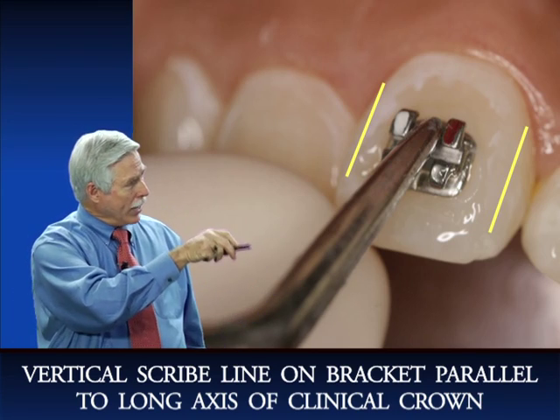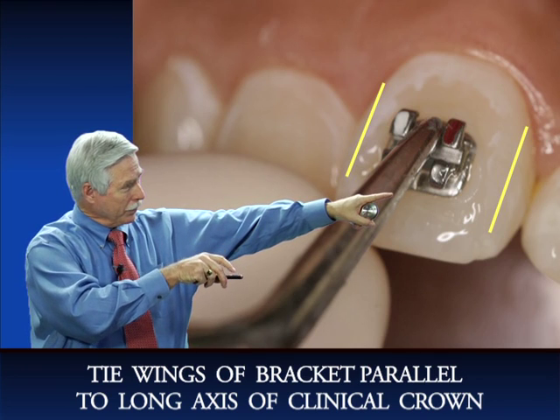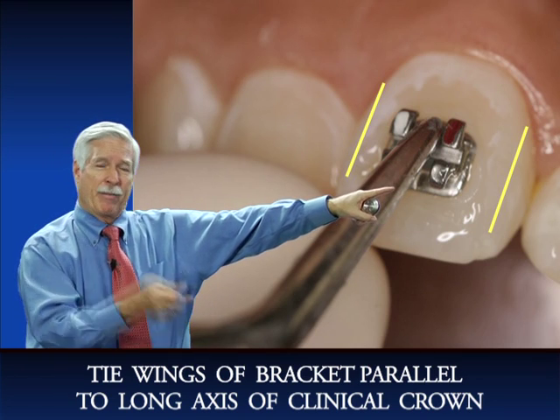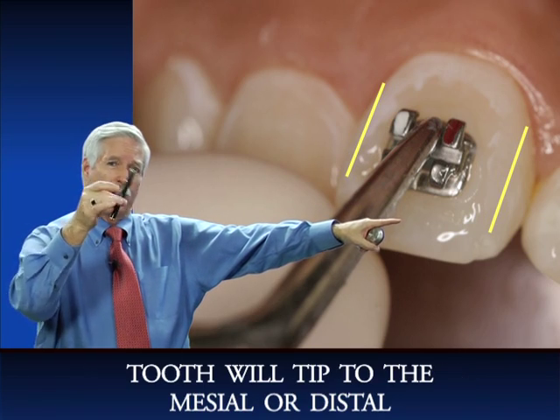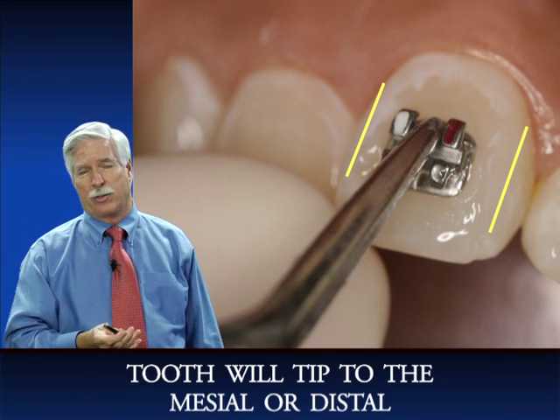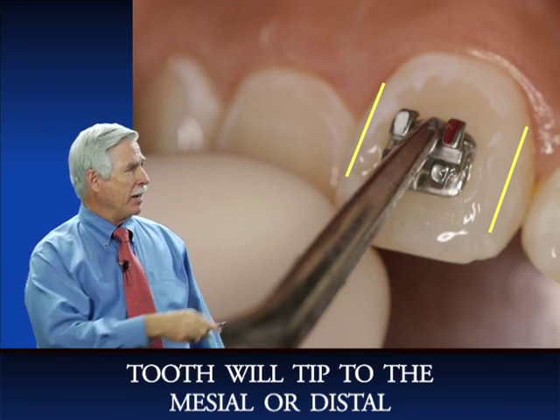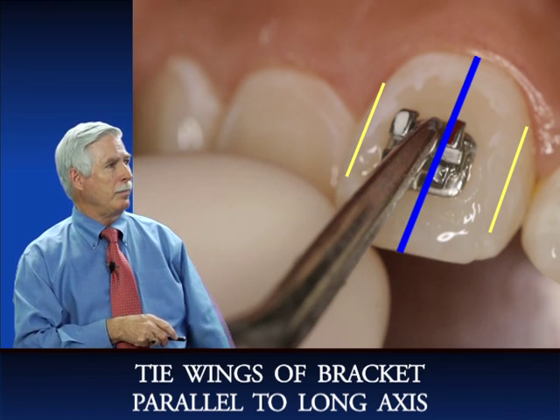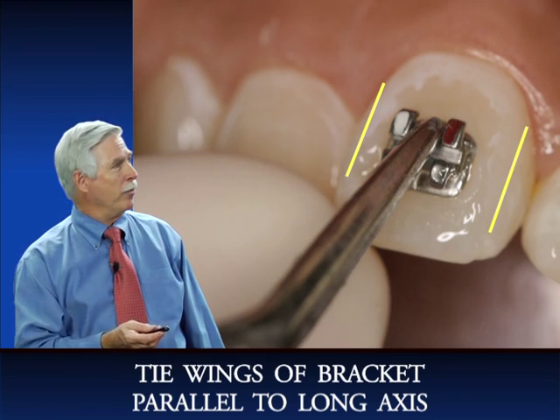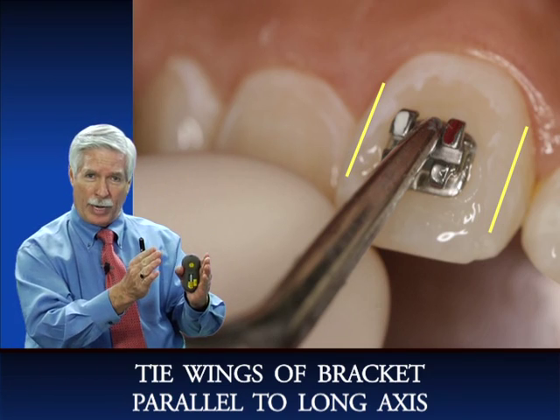So you can make sure the wings of the bracket are parallel to the long axis. That's extremely important. If the wings of the bracket are not parallel to the long axis, and they go on an angle like this, you will actually tip the tooth to the mesial or distal, and that's not good. So to prevent tipping, you have to have the wings of the bracket parallel to the long axis. So that's cardinal rule number 4. Wings of the bracket parallel to the long axis of the tooth.